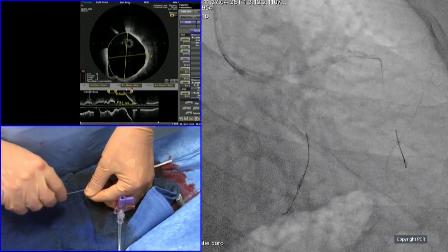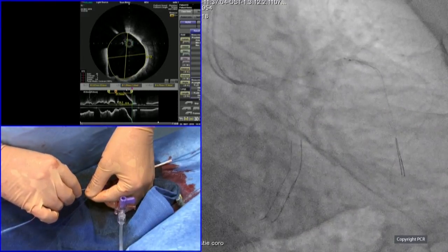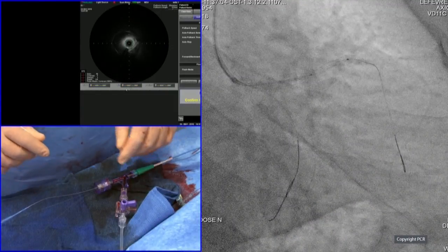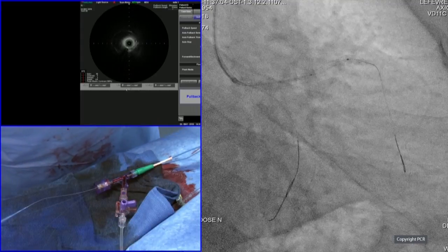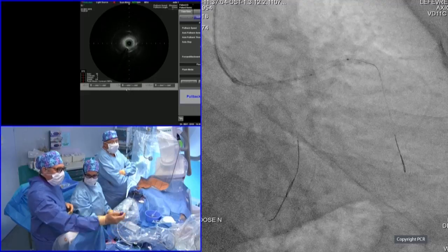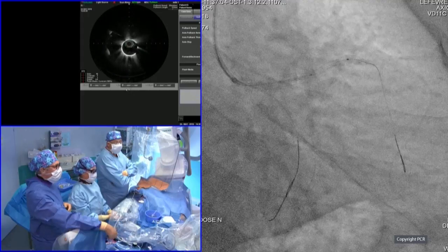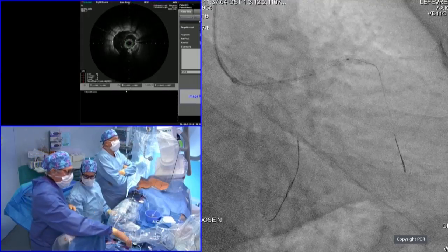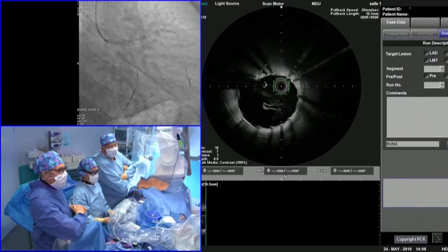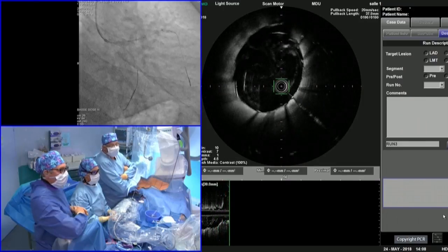One thing we should really definitely avoid is the wire being outside of the stent. That can happen if you have a huge malposition in the proximal part. But I think we have a kind of recommended strut penetration point for the recrossing balloon. We are ready for the OFDI. Okay. But it really depends on the configuration of the stent and how it is positioned in the side branch ostium. So maybe we will show one example here of how we can do that.